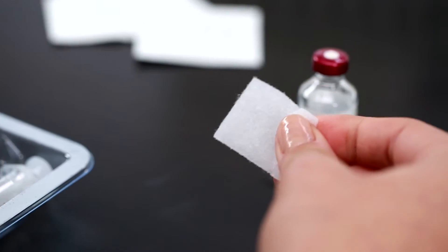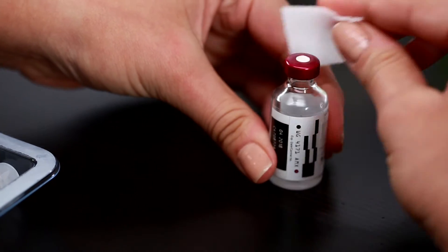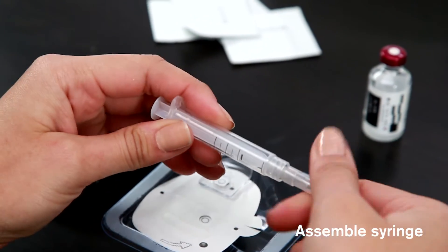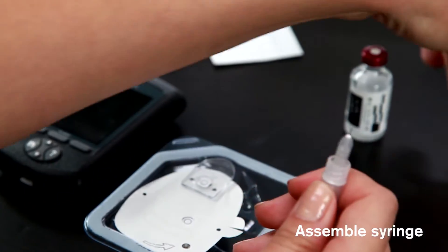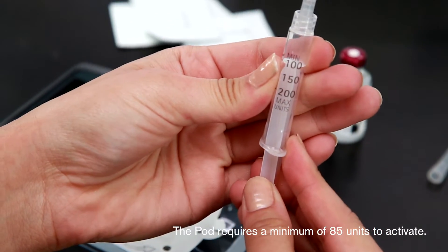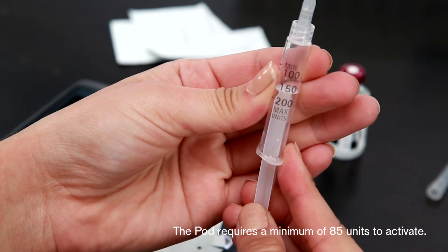To fill a new pod, use an alcohol swab to clean the top of the insulin vial. Assemble the fill syringe by twisting the needle onto the syringe and then remove the protective cap. Draw air into the fill syringe equal to the amount of insulin you intend to fill the pod with.